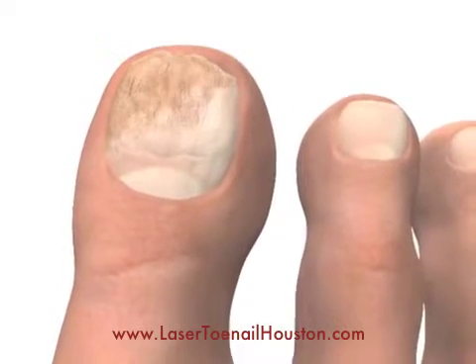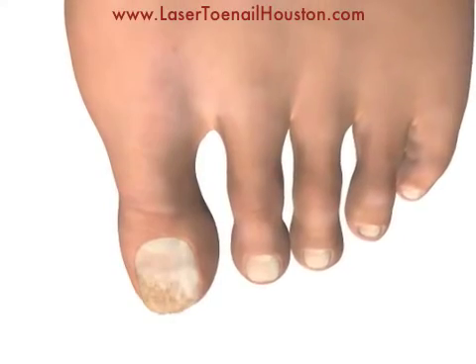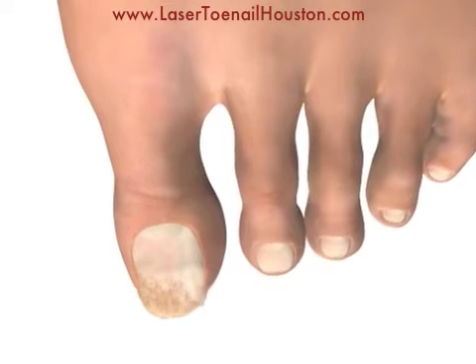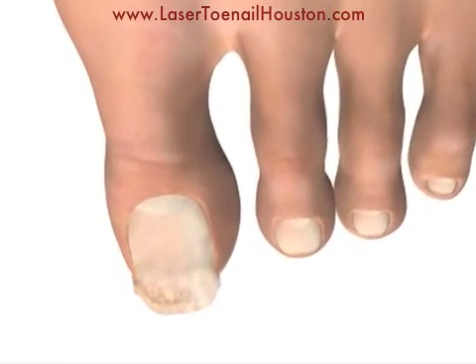The fungus is dead, but you have to wait for the damaged areas of the toenail to grow out. You gradually trim off all of these damaged crumbly areas of the toenail over the next few months. Then you will have clear toenails.